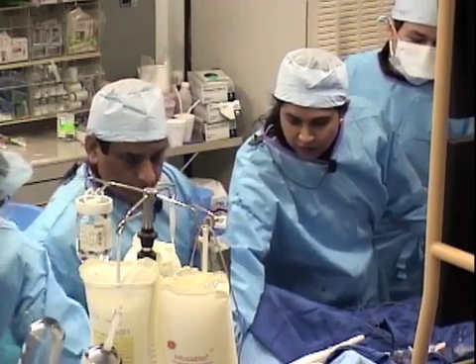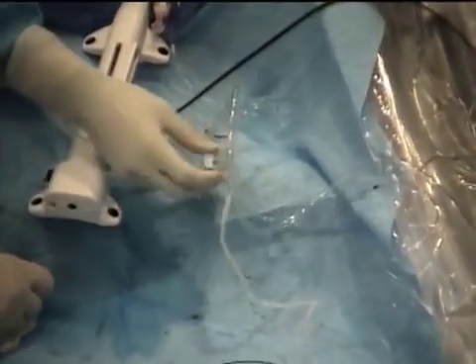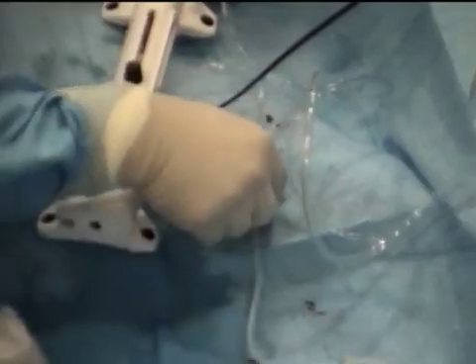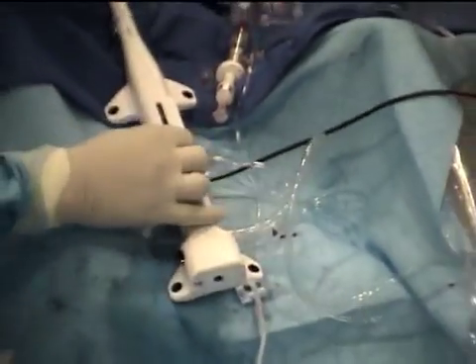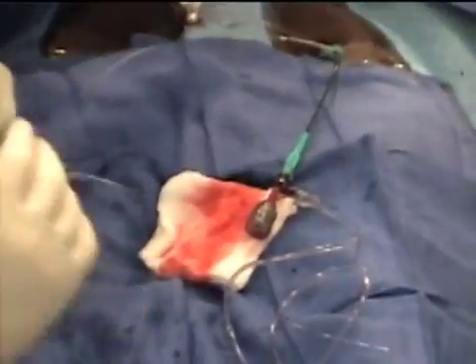What happens is, if they have it ready, the flush is usually disconnected. So what you have to do is make sure you are open and you see the flush dripping. That's the only way you know we are ready to go in with the rota.